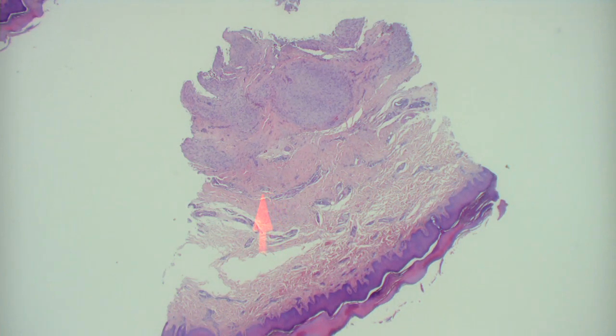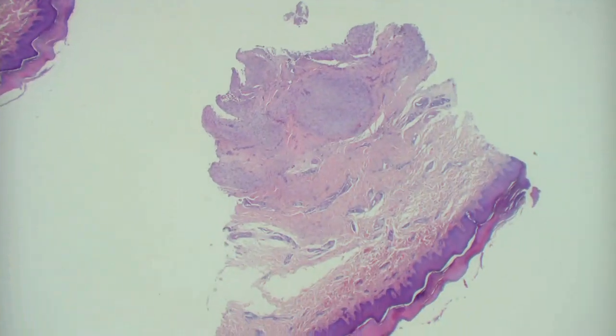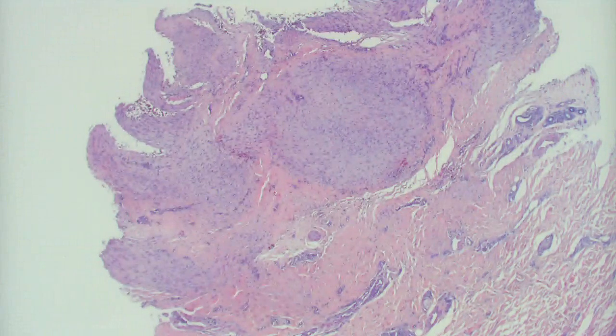It looks like in some sections it's getting to the sub-Q. Maybe even below that. Like here's some subcutaneous fat here, so maybe it's even beneath the subcutaneous fat. It looks like from here you could see that it's not very well demarcated. It's composed of spindle cells.